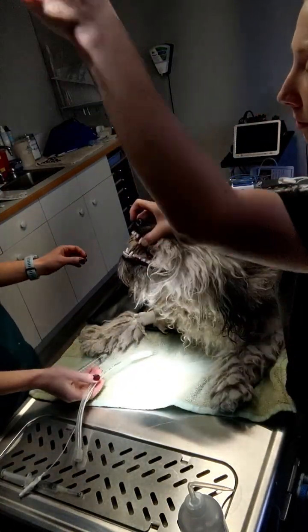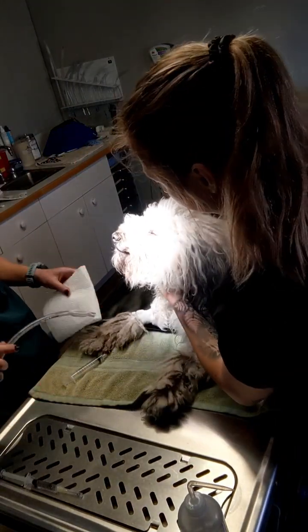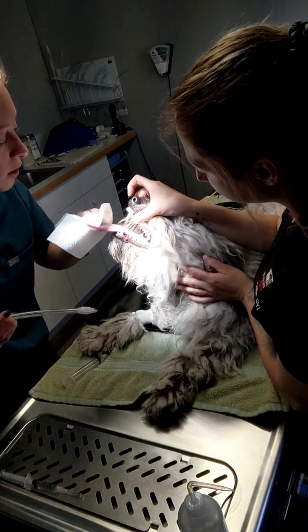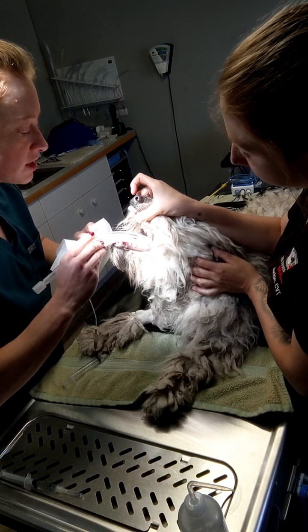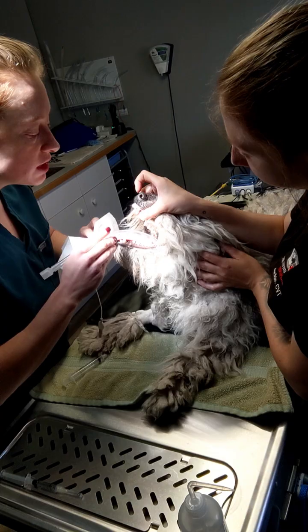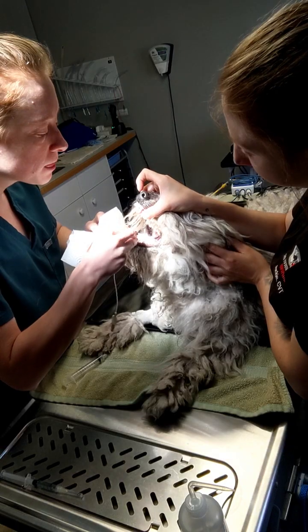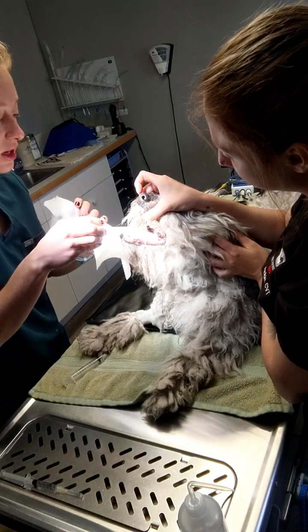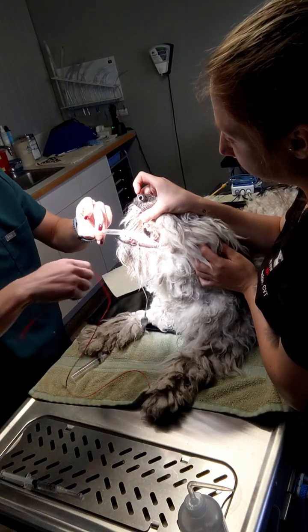So Jackie's gonna hold the mouth open for me. Can you get a paper towel just to pull the tongue aside? So I will intubate by putting the cuff end of the tube back and against the soft palate. I'm gonna lightly press against the soft palate to make sure I can go directly into the trachea, and I'm just gonna guide the tube into the trachea until it is well seated, and as long as it is placed, we'll secure it.